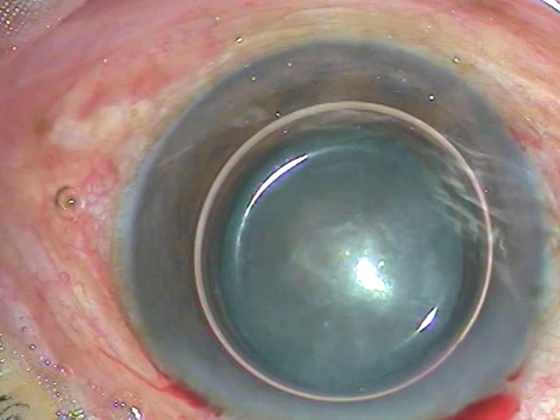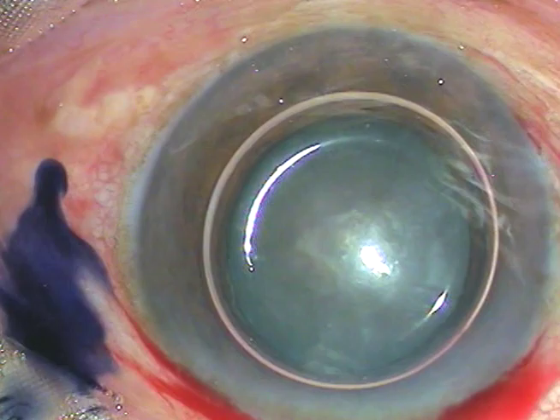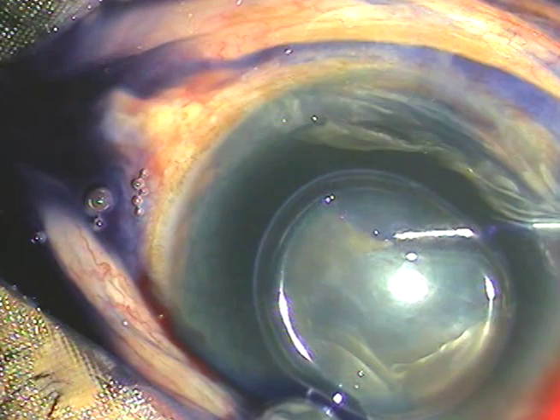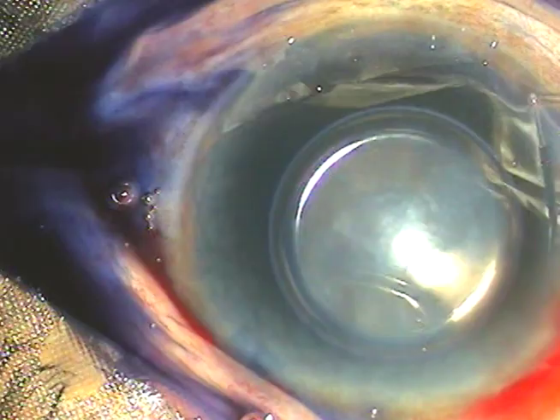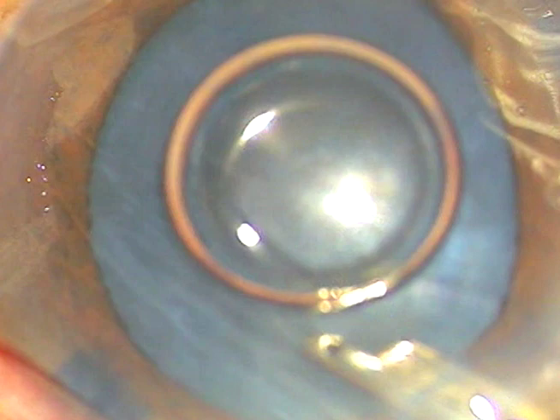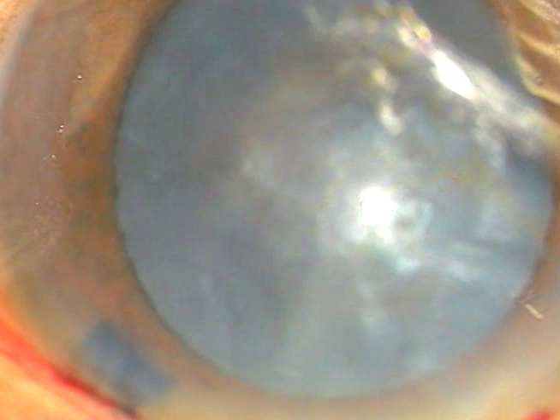A big air bubble has been injected into the anterior chamber. Trypan blue 0.06% dye is then injected into the anterior chamber over the anterior capsule. The dye has not stained an area inferiorly, so I go through the side port and stain that area — all areas of the anterior capsule must be stained. The dye is immediately washed out; you don't have to wait long, and the capsule has stained very nicely.